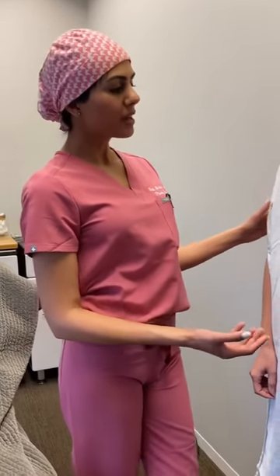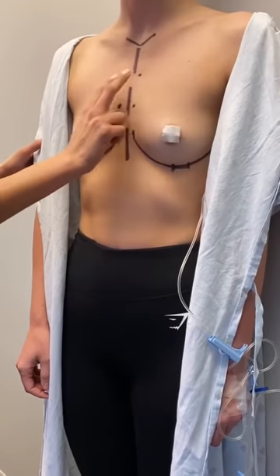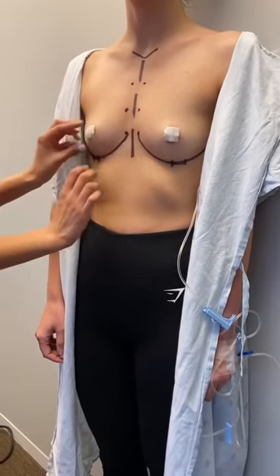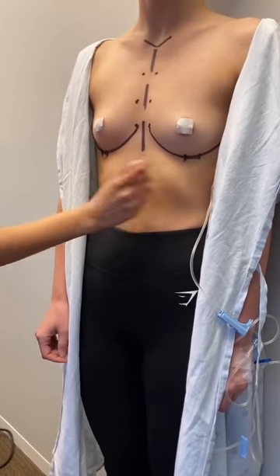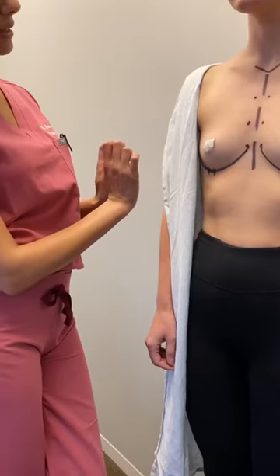We just finished marking. Here she is with her midline marks — that's her chest bone, respecting her natural space so we can achieve beautiful cleavage. This is also her fold, and this is where her incisions are going to be: small, two-and-a-half centimeter incisions in her crease that we'll use to place silicone implants underneath the muscle.